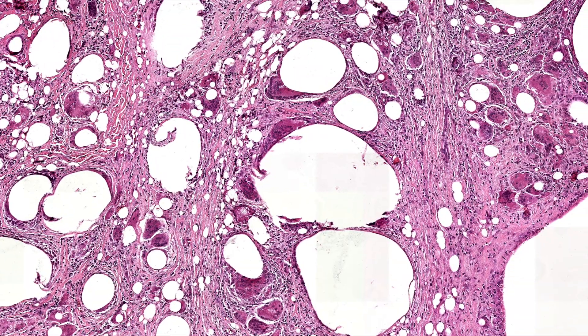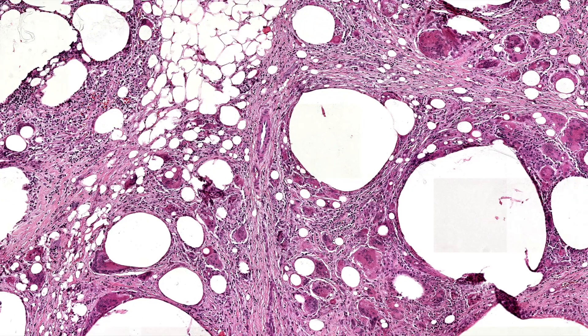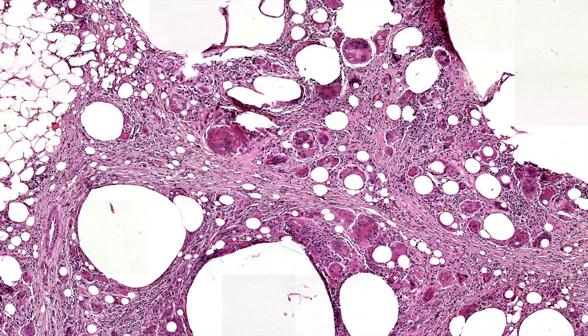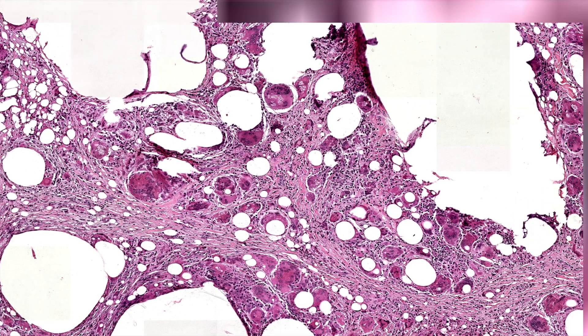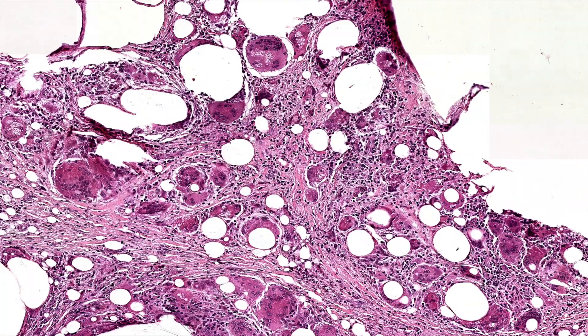My recollection is that silicone will not actually polarize. Silica — I think silicate, like sand-type material — can polarize. But the silicone used for implants I don't think polarizes. You can look and see that it's refractile, and multinucleated foreign body giant cells often with bubbly little vacuoles.